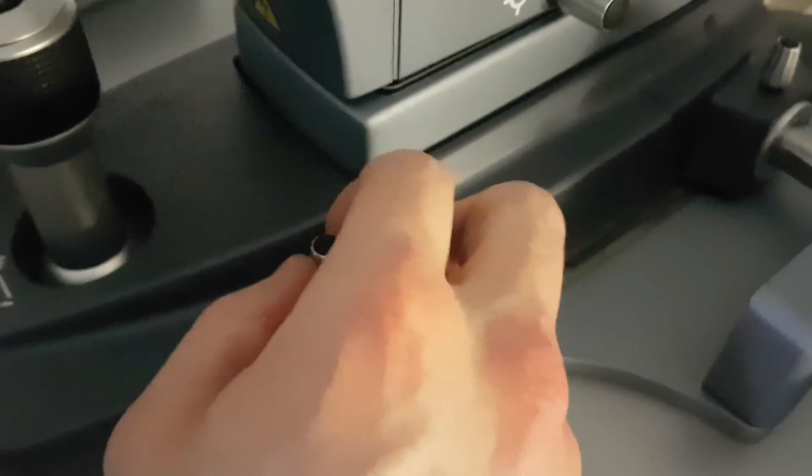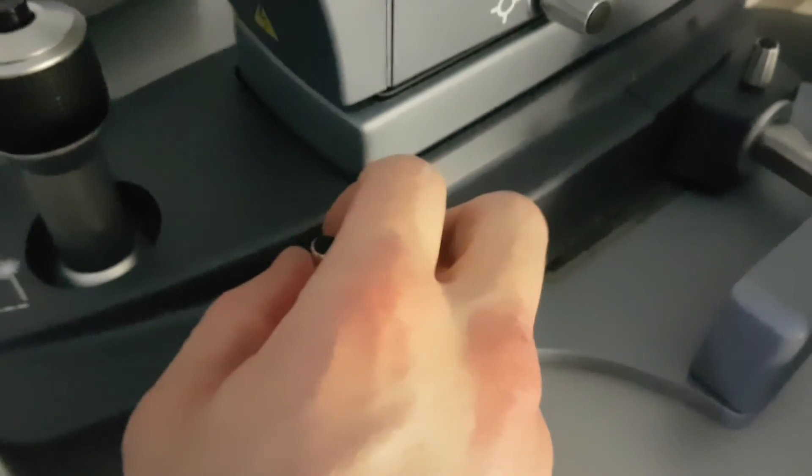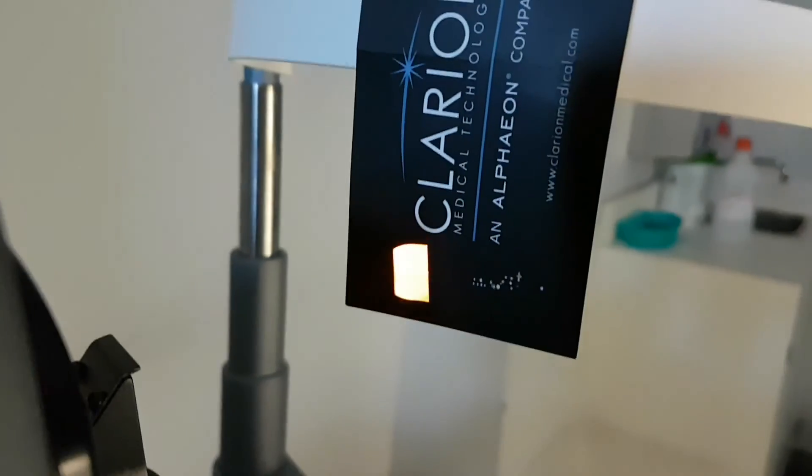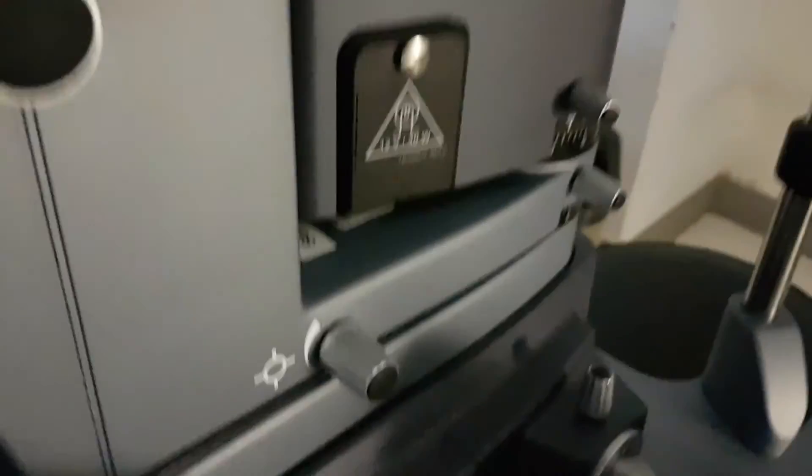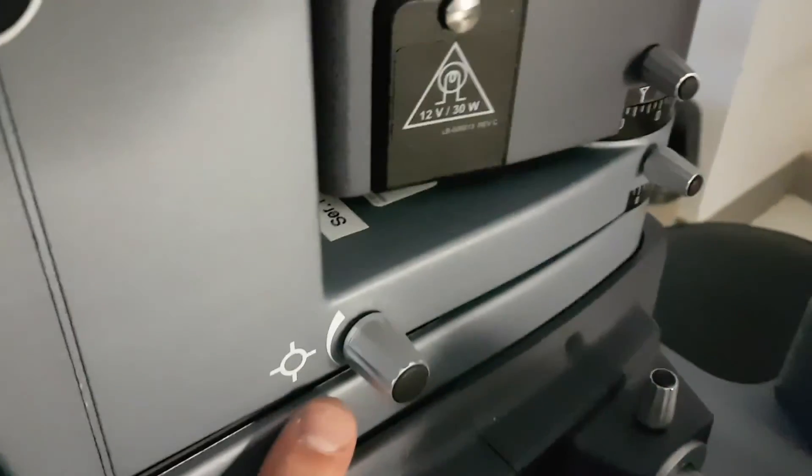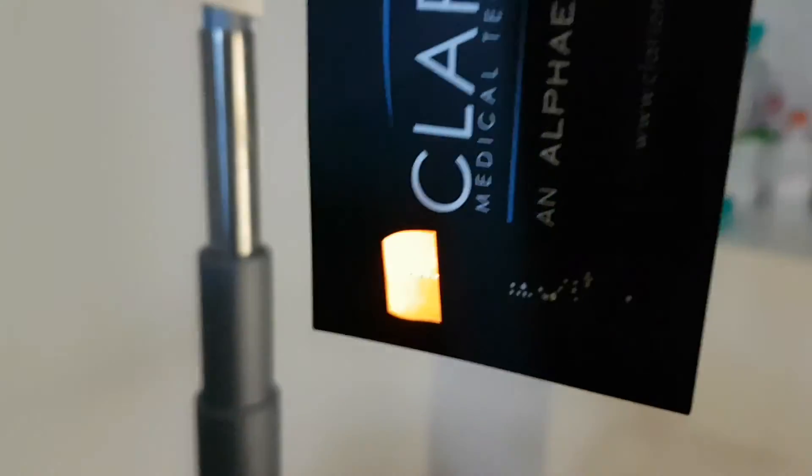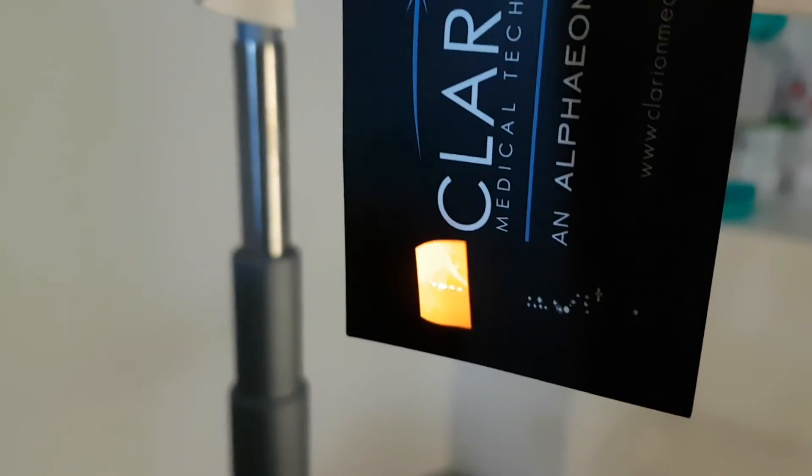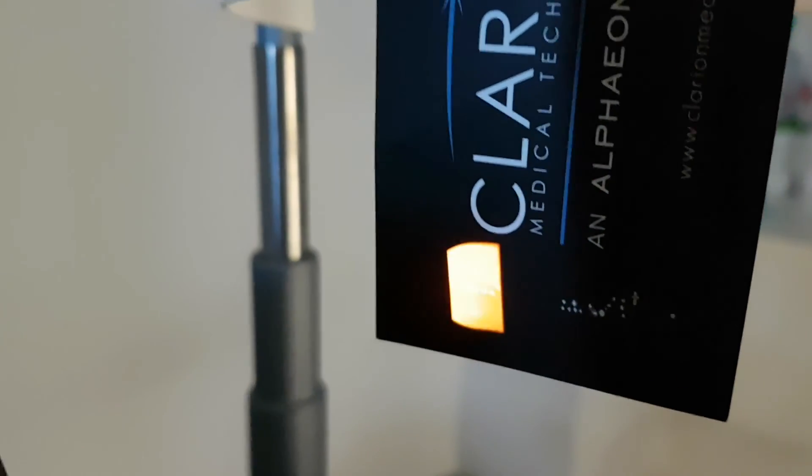And the aiming beam is right here. And that does... Could you do it? Yes, of course. Thank you.